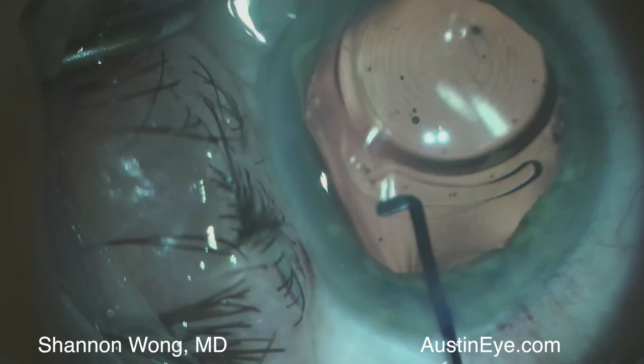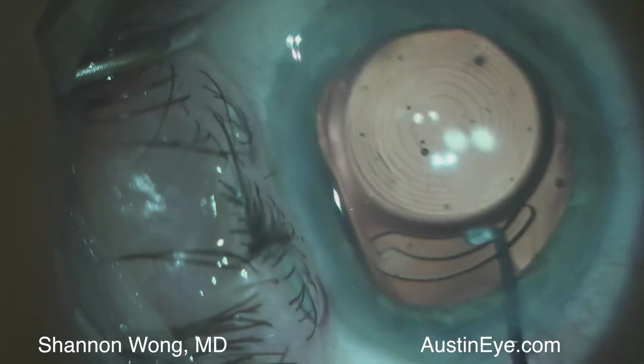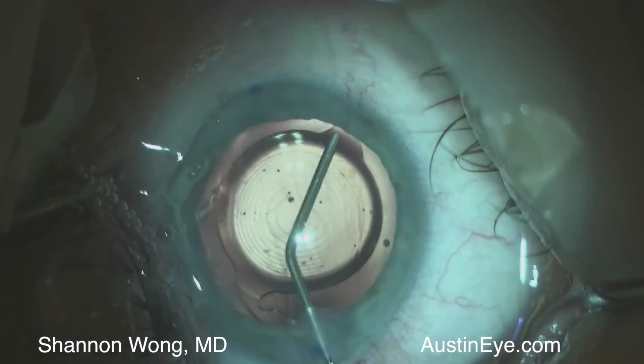The lens centers perfectly. The posterior capsulorexis remains intact and we inject triamcinolone, moxifloxacin and vancomycin made by Imprimis Pharmaceuticals into the vitreous through a transonular approach.